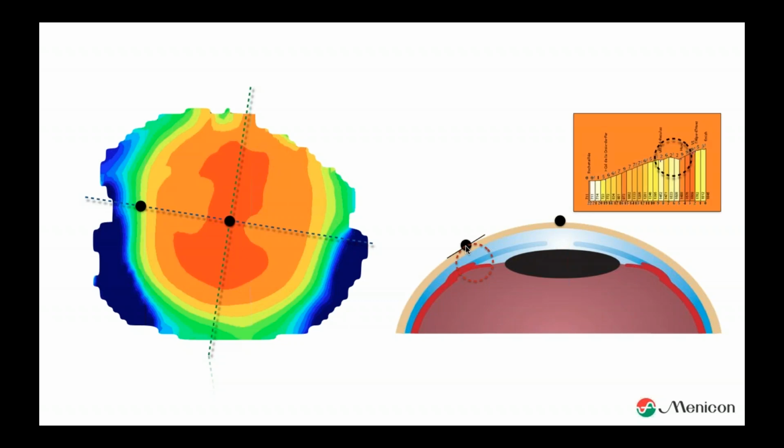So if we go to the mountains altogether, and we see a kind of roadmap, then you can see, okay, it's not a steepening of 10%. This is where the steepening takes place, and where we go back down, and where the steepening is again. So we have much more information. We have very localized information, and that's the exact reason we use the tangential map so often for ortho-K, because we can see very much in the periphery what the curvature will be.